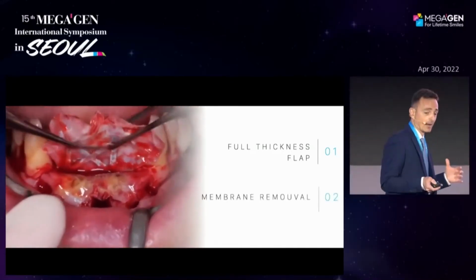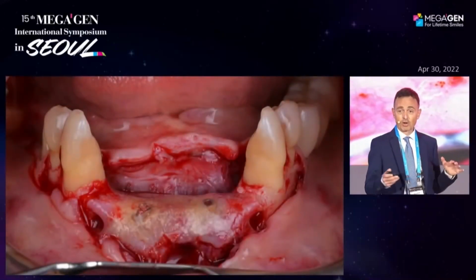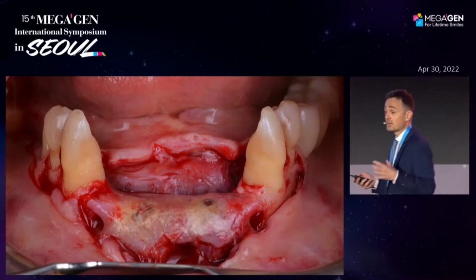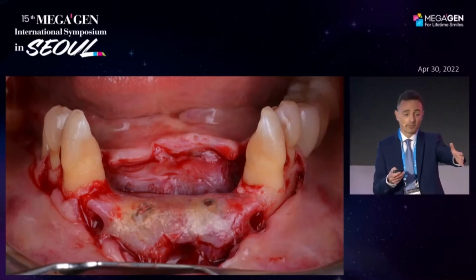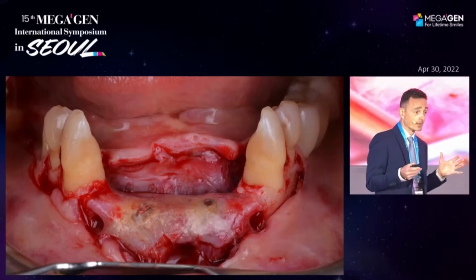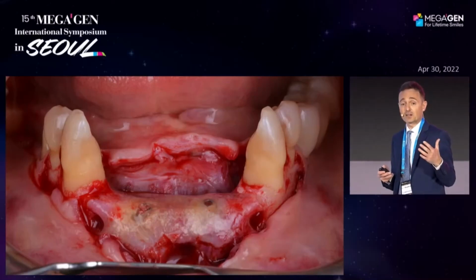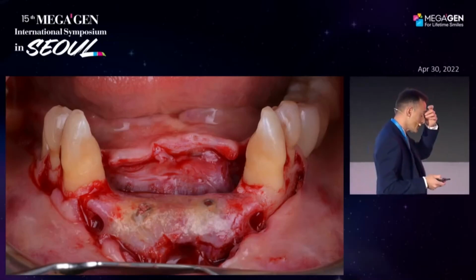And I'm not scared about the clinical situation that I'm finding in this picture, because you know, in the crestal part we have yellow biomaterial, yellow regenerated bone. Obviously, the regenerated bone after 8 months is not mature. And I'm more than happy to see what I'm showing you in this picture. And you have also to consider that after a few minutes, you will place the periosteum on the crestal part of the regenerated bone. And at this moment, we will start again a revascularization from the periosteal part.